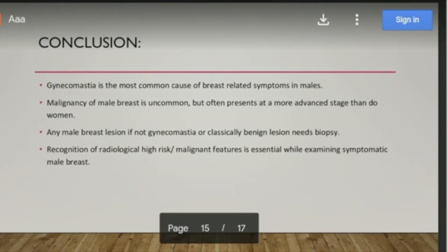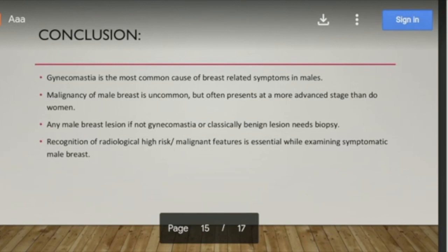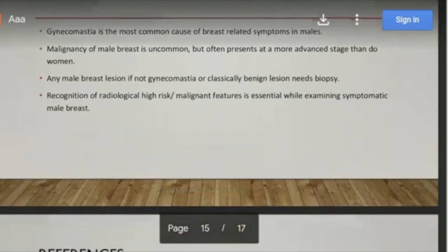In conclusion, gynecomastia is the most common male breast pathology — usually bilateral, subareolar, and painful — and should be ruled out before diagnosing any other pathology. Malignancy, though uncommon, usually presents at a more advanced stage than in women. Any male breast lesion that is not classically gynecomastia or benign needs biopsy. Recognition of high-risk radiological and clinical features — such as firmness, nipple bleeding, unilateral or eccentric location — is essential in evaluating symptomatic male breast.